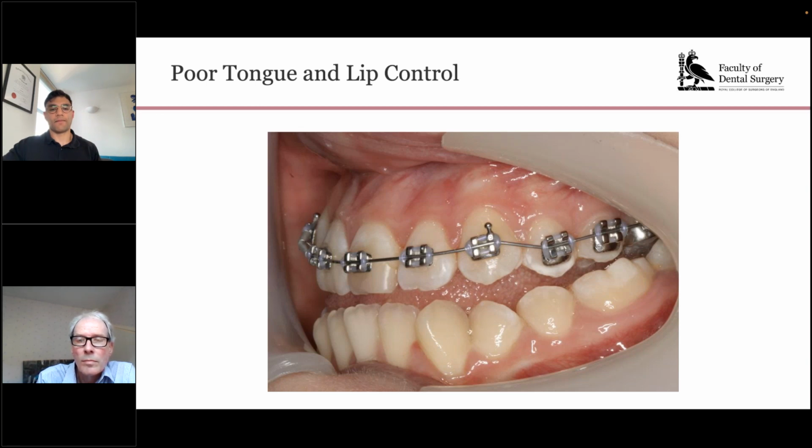Okay, thank you. Simran wants to know, would you recommend a ring flash over a twin flash? I think I would, especially if you're getting into dental photography. Because technology progresses so quickly, one of the things that we've seen come about and used more often are twin flashes. And as I say, they probably do give you a more exemplary image, but a ring flash will give you pretty much 95% of the way there.